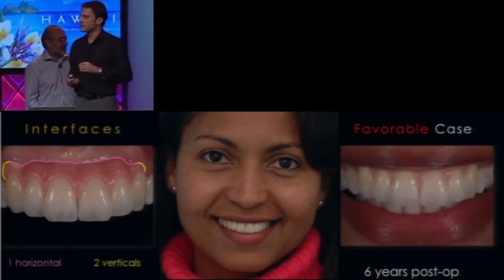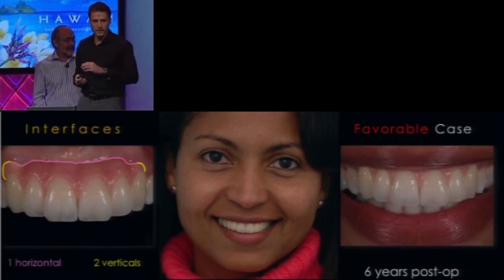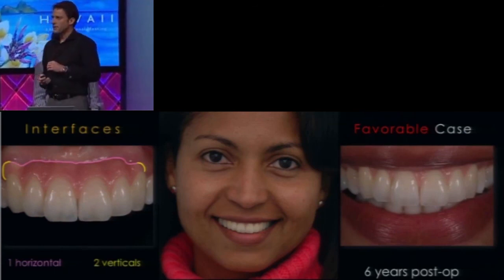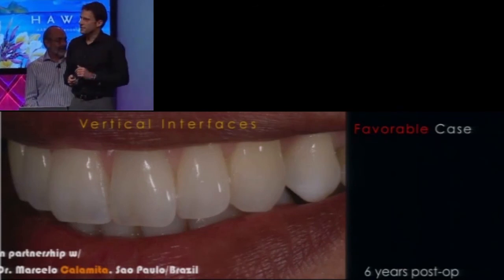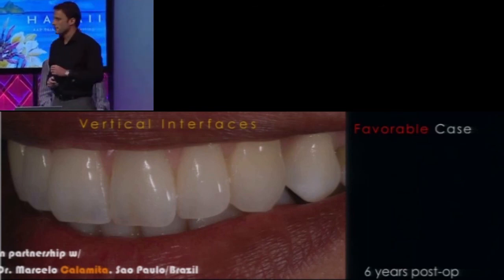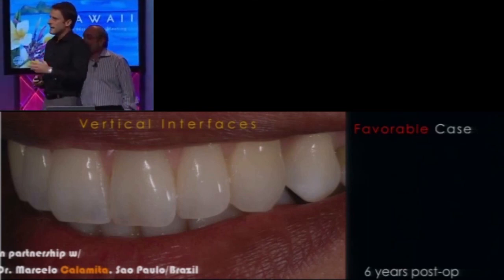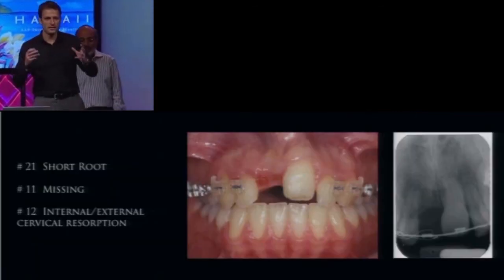And we see that this is a favorable case, mainly because the horizontal interface is hidden behind the upper lip, and because the 2 vertical interfaces are actually hidden behind the cuspids. So it's a case that we solved with pink ceramics, and we've been doing pink ceramics for a long time, and it's a perfect case for pink ceramics because the interfaces are not inside the aesthetic zone.